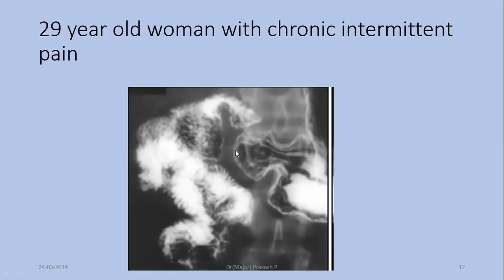Okay, so most of you have found the finding correctly. It was a barium meal follow through. Okay, it is not a double contrast barium meal as many of you have seen typing. Okay, it is a barium meal follow through study. Okay, as many of you have pointed out, the jejunal loops are seen on the right side. Okay, the same patient's images.